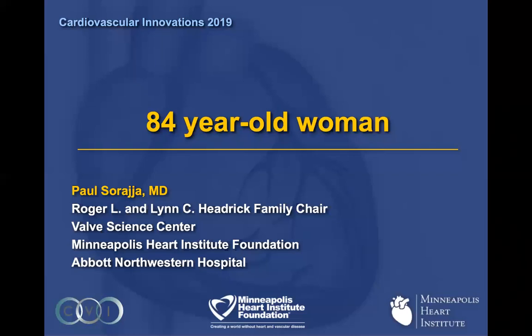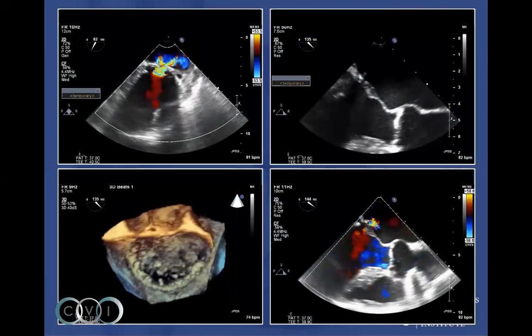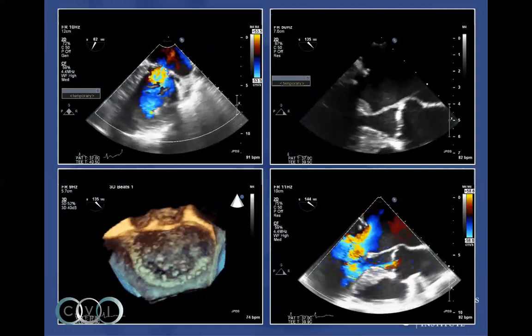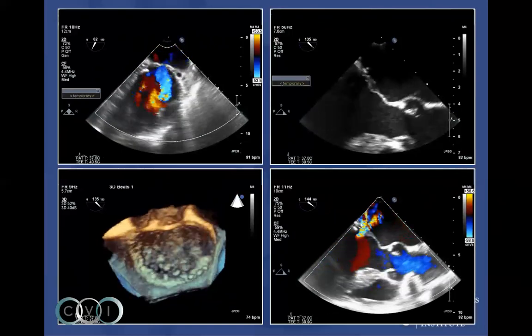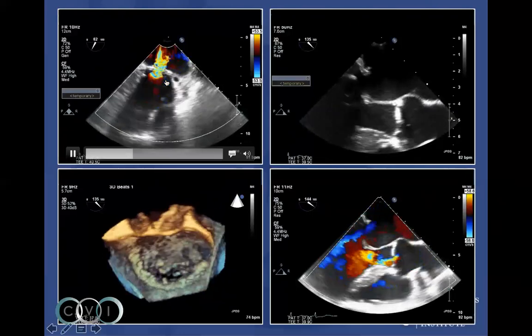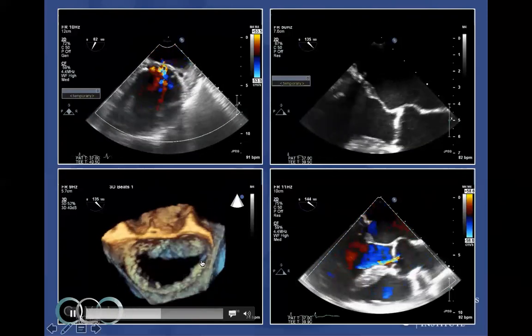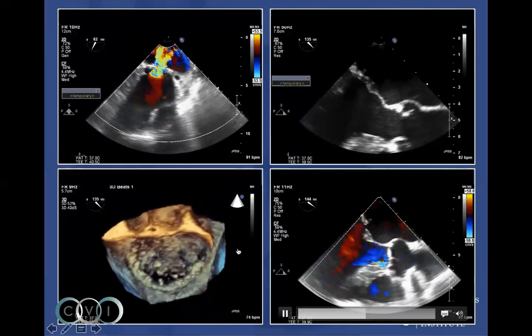Here's an 84-year-old woman who had a previous repair about nine years before she came to see me. She had shortness of breath for the previous six months, was quite symptomatic — not able to do much around her house — and also quite frail. She really did not want another surgery. Her echocardiogram shows that despite an early good surgical result in terms of MR relief, at about eight years later she's got a lot of mitral regurgitation. What was done was a partial annuloplasty, and essentially the annuloplasty has moved away from the trigones of the mitral valve, resulting in this MR.